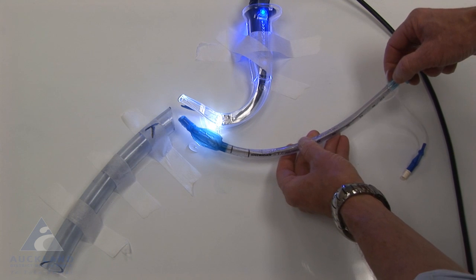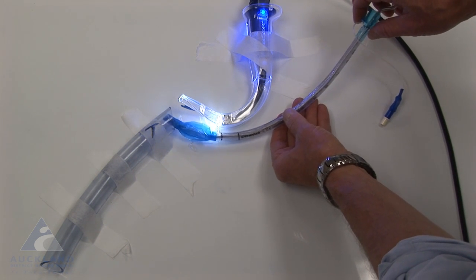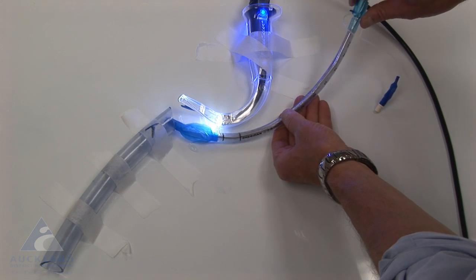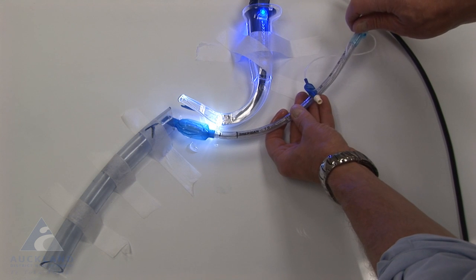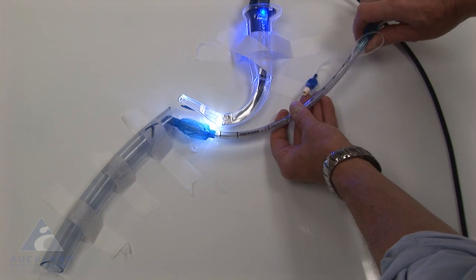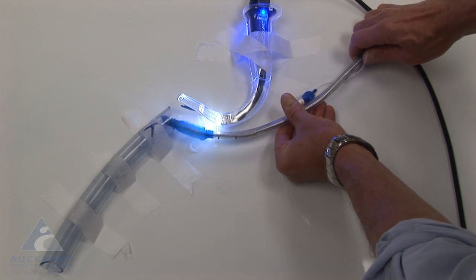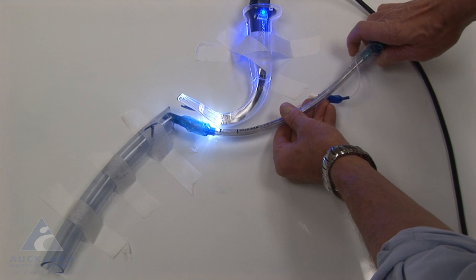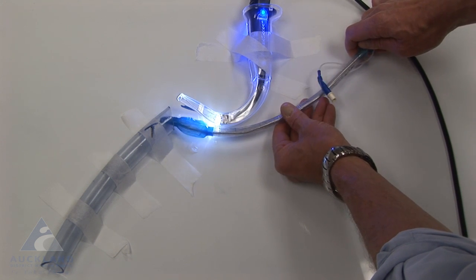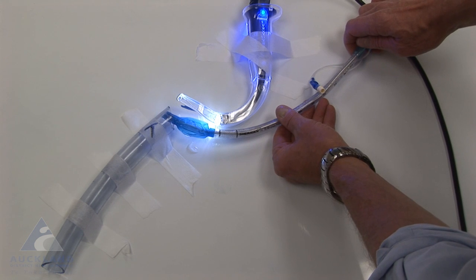Now the reason for this is that should you get a tube in this position here and you're really trying to have it advance down the trachea, it's very helpful if the tube itself starts to spin, and it will break the friction at the tip, whether it's up against the mucosal wall or whether it's up against the tracheal ring. And once it's rotating, as you can see it doing now, then it will start to advance itself down through the trachea because the spinning has allowed it to break that friction.